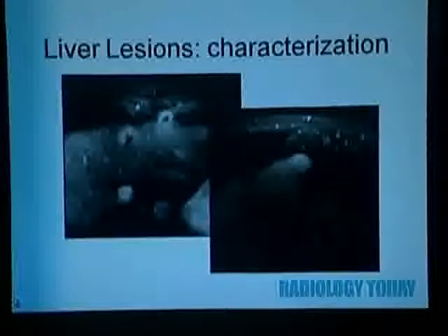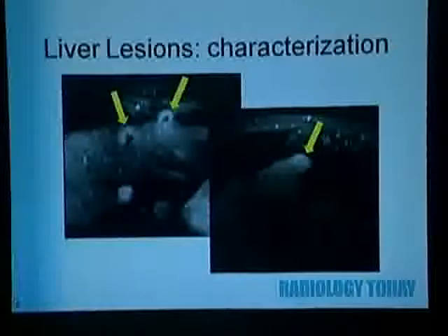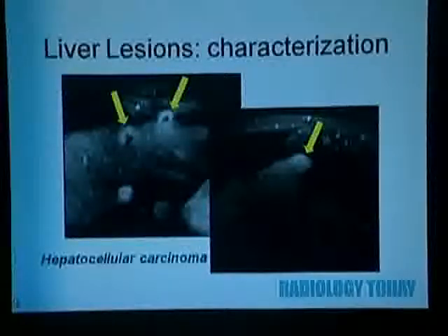This is a case of a patient who had hepatitis B and long-standing cirrhosis, which was known. She had a bump in her alpha-fetoprotein, which was being monitored by her clinicians, so an MRI was obtained. She had multiple regenerative and dysplastic nodules, but a couple of these masses were enhancing with high T2 signal and rapid washout. And unfortunately, this was a multifocal hepatocellular carcinoma.